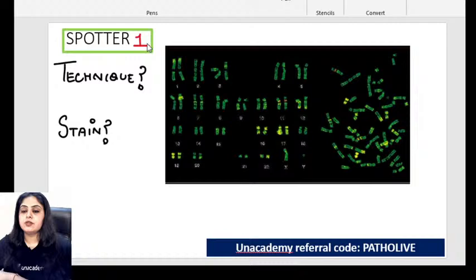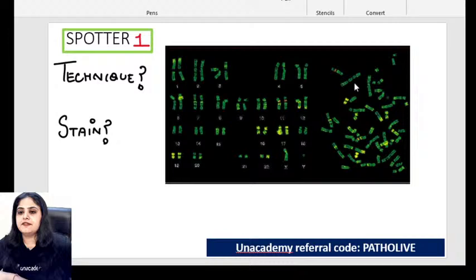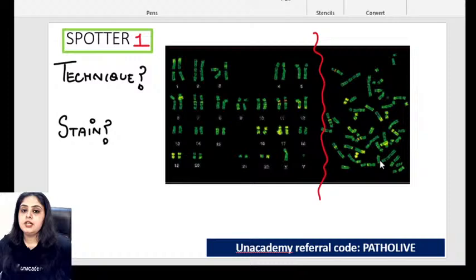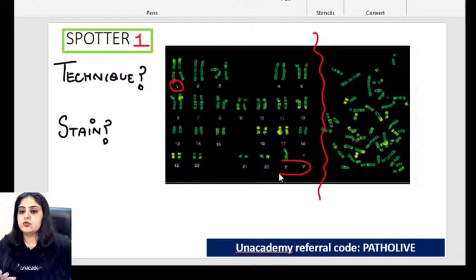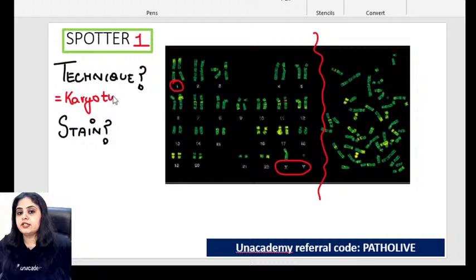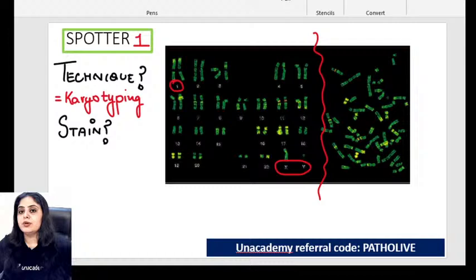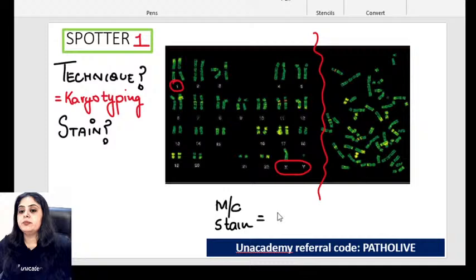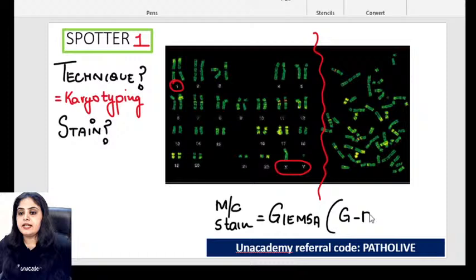Some people say FISH, some say karyotyping. It does look fluorescent, but if I divide this picture into two parts — on one side the chromosomes are all haphazard, and on the other side they've been arranged very nicely from chromosome 1 to chromosome 23. That arrangement, with only one green fluorescent color, is karyotyping. For karyotyping, the most common stain is the Giemsa stain, which is why we call it G-banding.